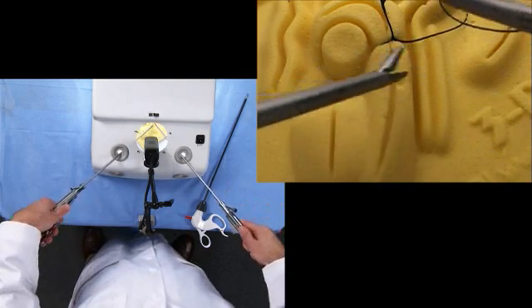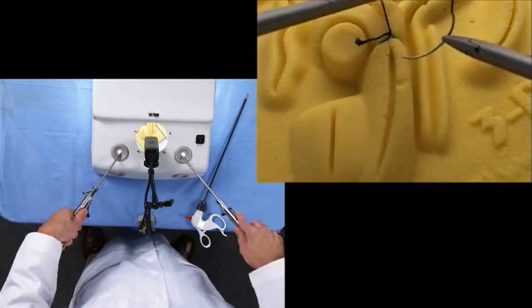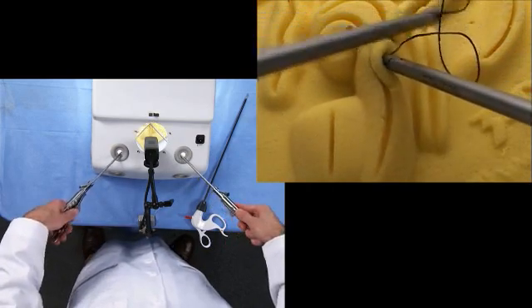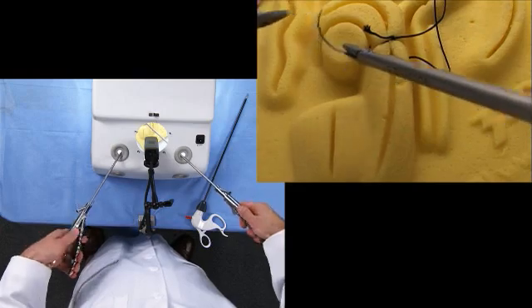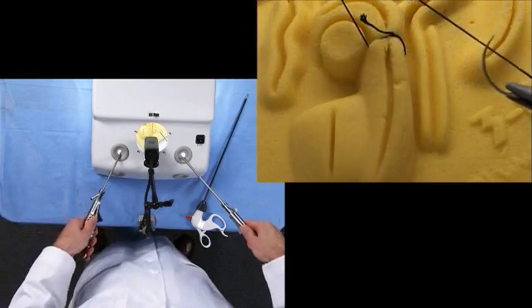Re-grasp our suture and drive through. Rotate out, assist with our left hand.